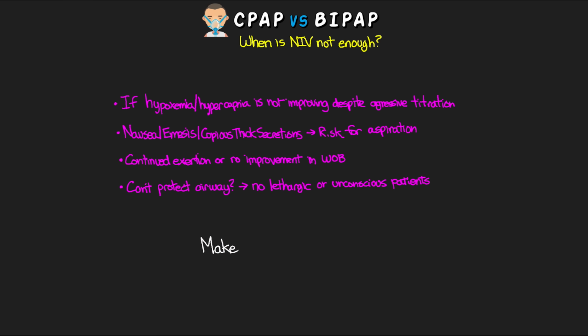Ultimately, the big takeaway here is we want to make the decision to move on from our non-invasive ventilation and into intubation proactively, as opposed to waiting until our patient tuckers out and now we're emergently intubating. All right, you guys, that's going to be the end of this lesson here.